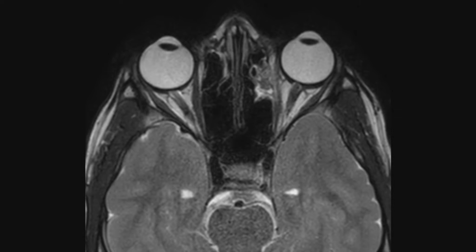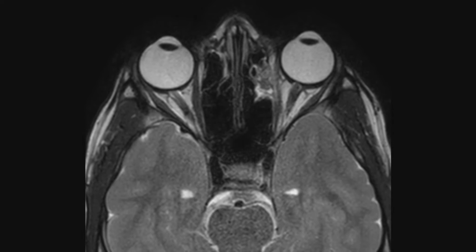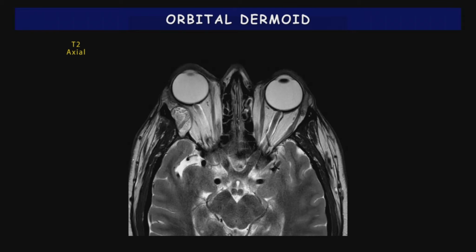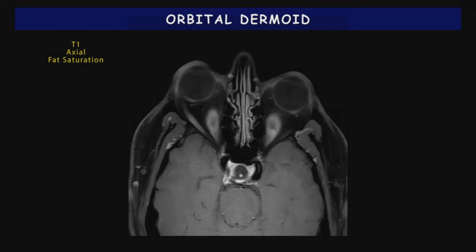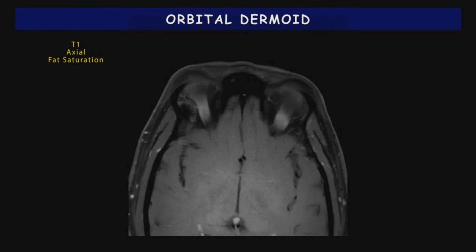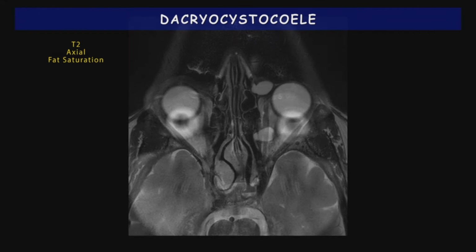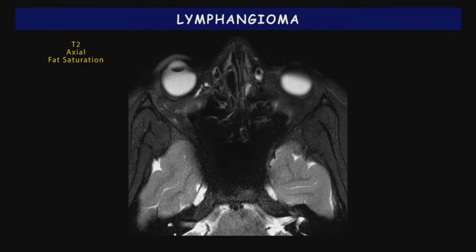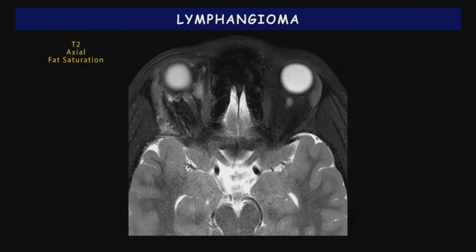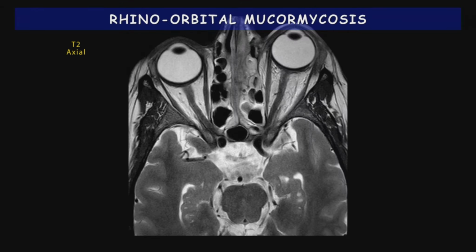Dynamic MRI imaging can be used for acquiring time series of images to demonstrate abnormalities of ocular motility and differential enhancement in mass lesions. Recent developments in technology, including orbital surface coils, fat suppression techniques, fast gradient echo pulse sequences, and MR contrast agents, have provided spatial and contrast resolution with direct multiplanar imaging, enabling us to study the lesions and surrounding structures extensively. MRI provides ophthalmologists with qualitative and quantitative information of various pathologies.